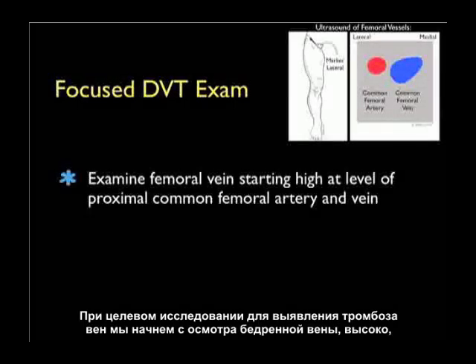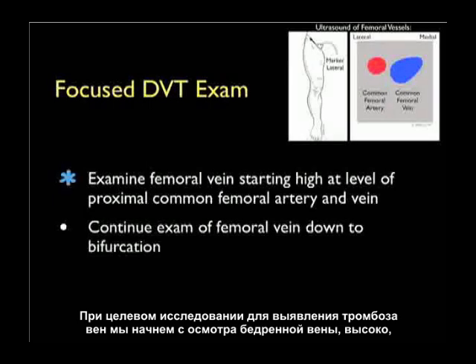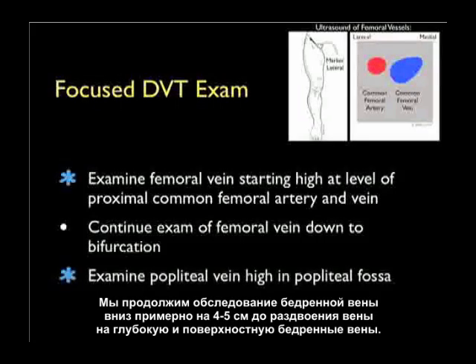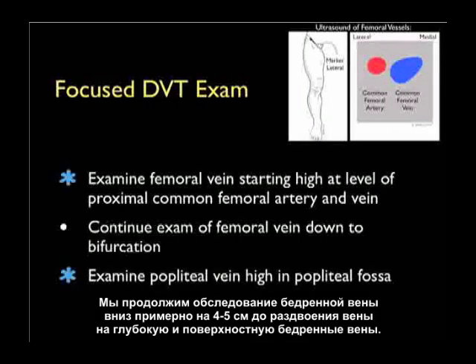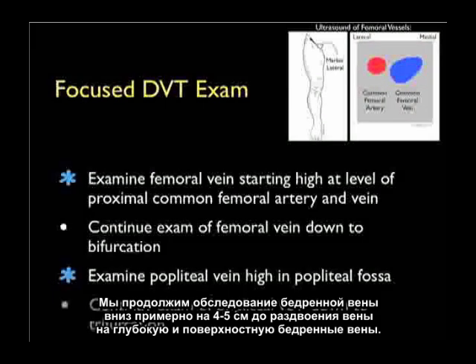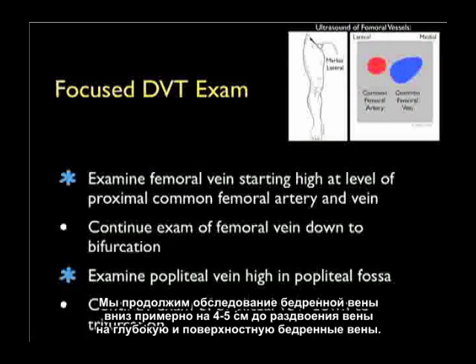In the focused DVT exam, we'll begin by examining the femoral vein, starting high at the level of the proximal common femoral artery and vein, just below the inguinal ligament. We'll continue the exam of the femoral vein down about four to five centimeters through to bifurcation of the vein into the deep and superficial femoral veins.